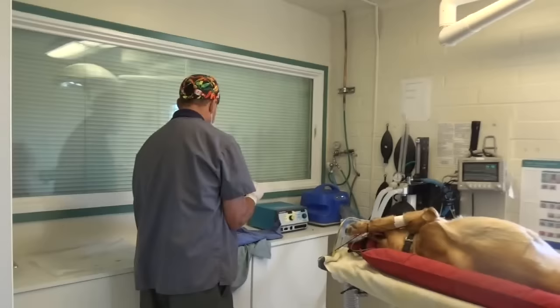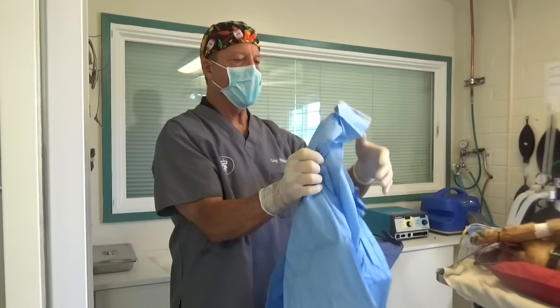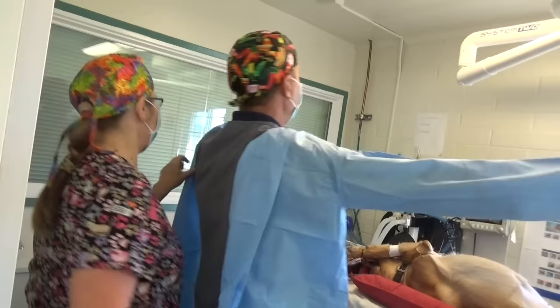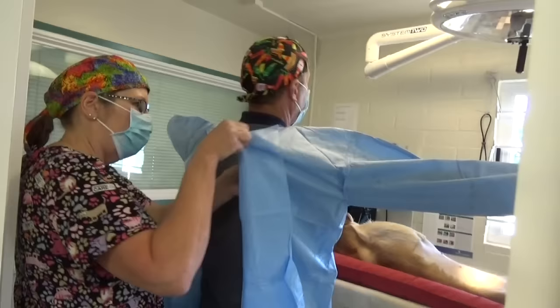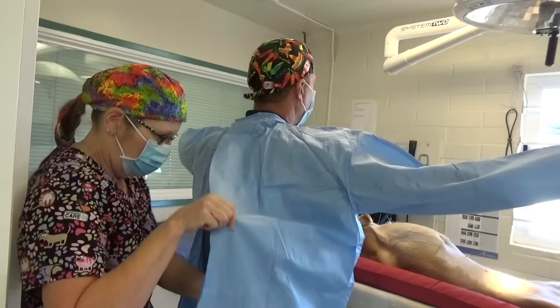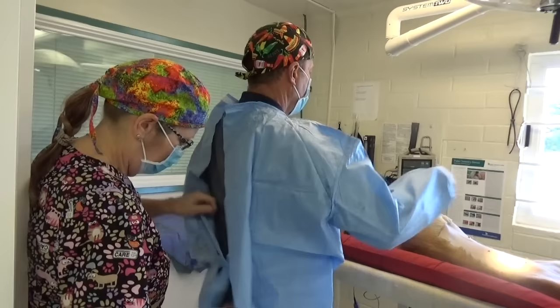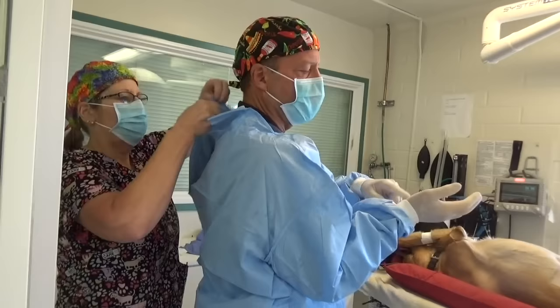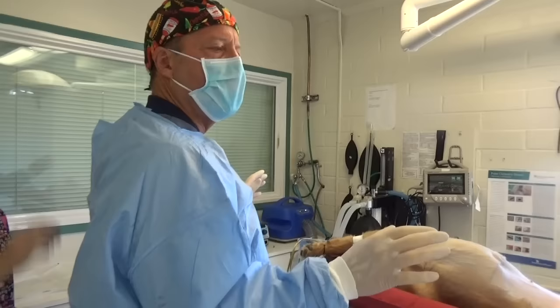This is the one thing that takes some time to put on because you've got to have people help you with it. It feels a little bit like a straitjacket, but it's not. Okay, so I got my gown going on to protect this little girl from all the bacteria on my clothes or my body. Whoops. Let me go ahead and pull my gloves here. Some people like to put their gloves on afterwards, some before. But as long as they're on, sometimes you put your gloves on the outside, but I usually do it this way, it's easier. Mine is tying me up.